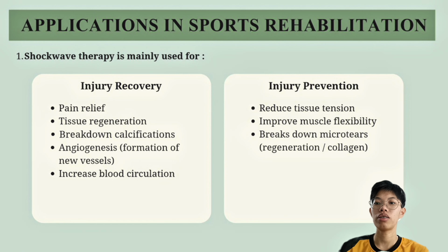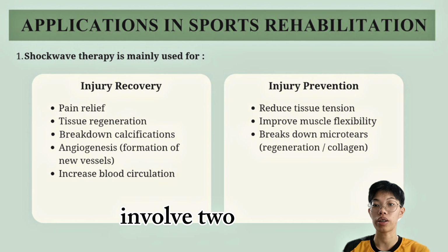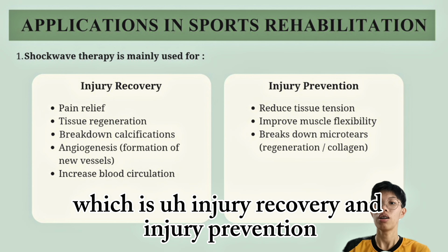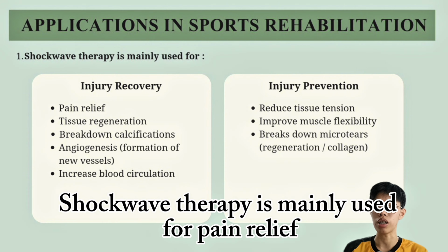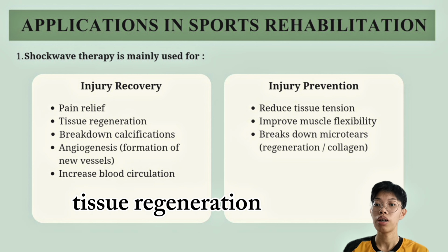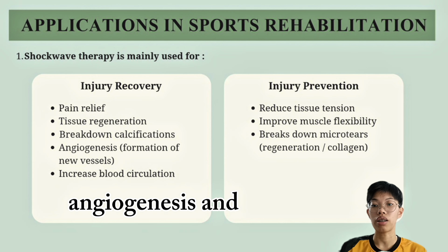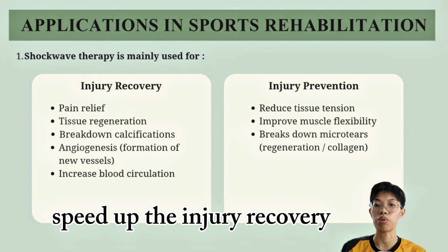The applications of shockwave therapy in sport rehabilitation involve two categories: injury recovery and injury prevention. For injury recovery, shockwave therapy is mainly used for pain relief, tissue regeneration, breaking down calcifications, angiogenesis, and increased blood circulation. All this is to speed up the injury recovery process.